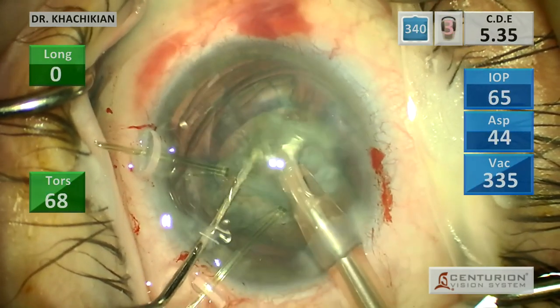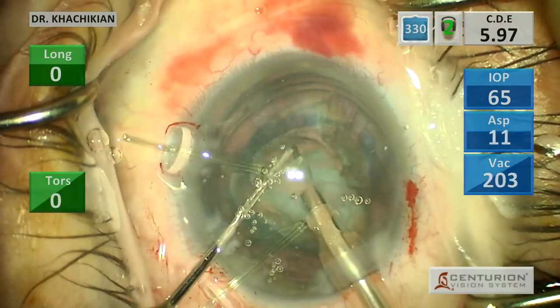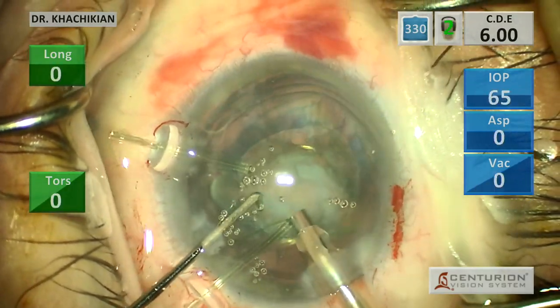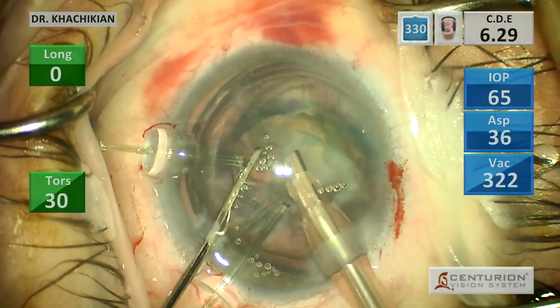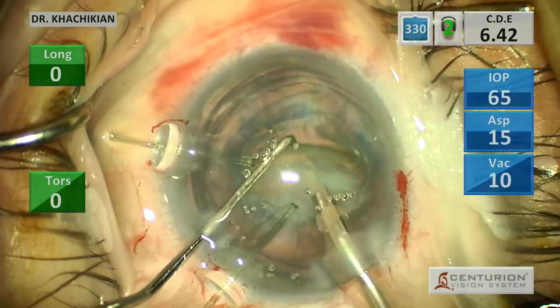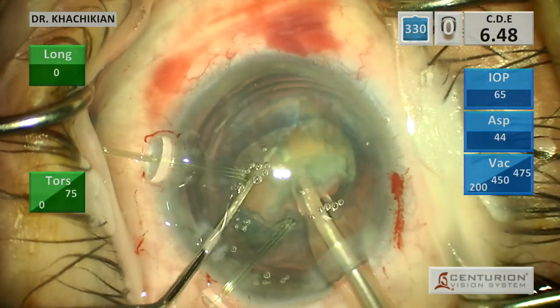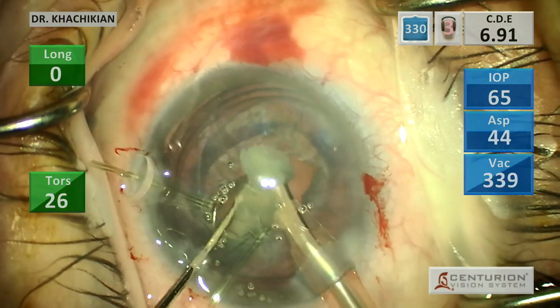We kind of lucked out there because they don't always do that. It's a softer lens that doesn't want to chop sometimes - in those cases, maybe you can prolapse the lens out of the capsule. The lens is pretty stable. We're not doing a lot of manipulation, the hooks aren't moving a lot, the capsular bag isn't moving a ton, although it does look a little bit loose. We are getting the bulk of the lens out safely, keeping our phaco tip central.